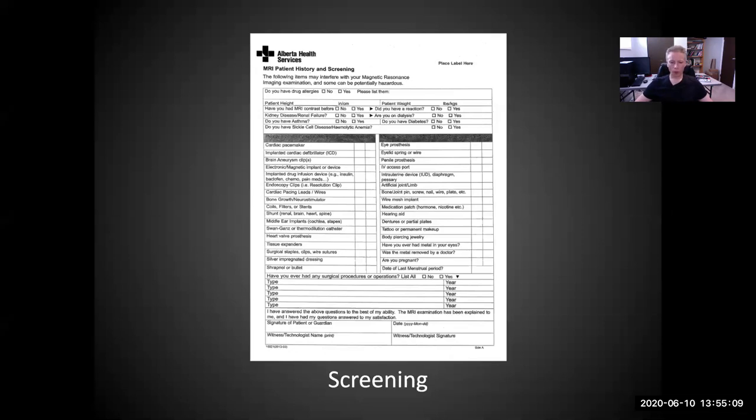Okay, so finally, the last couple questions here that you can see are related to pregnancy, and really what we want to ensure is that no one who believes that they are pregnant or has cause to believe that it could be the case are scanned. Because even though pregnant women have been scanned for clinical reasons, we would rather not take any additional risk. And that's our policy.